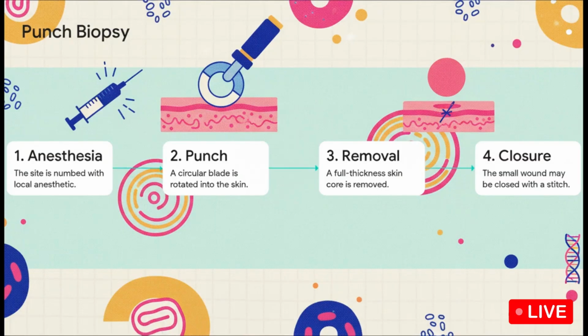A really common one here is the punch biopsy. It uses this neat little tool that honestly looks like a tiny cookie cutter. After numbing the skin, the doctor just twists it, and it removes a perfect little core of skin. The key takeaway here is that it gives a full thickness sample, getting everything from the top layer, the epidermis, all the way down into the dermis. And getting that full depth is absolutely critical for diagnosing a ton of skin conditions.